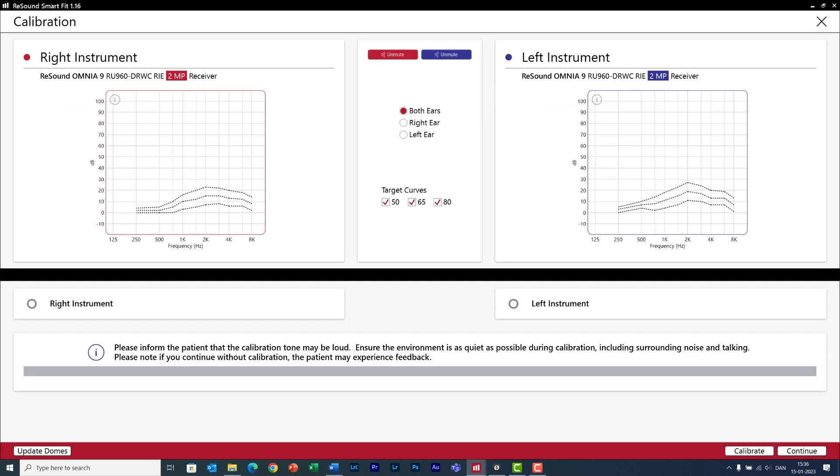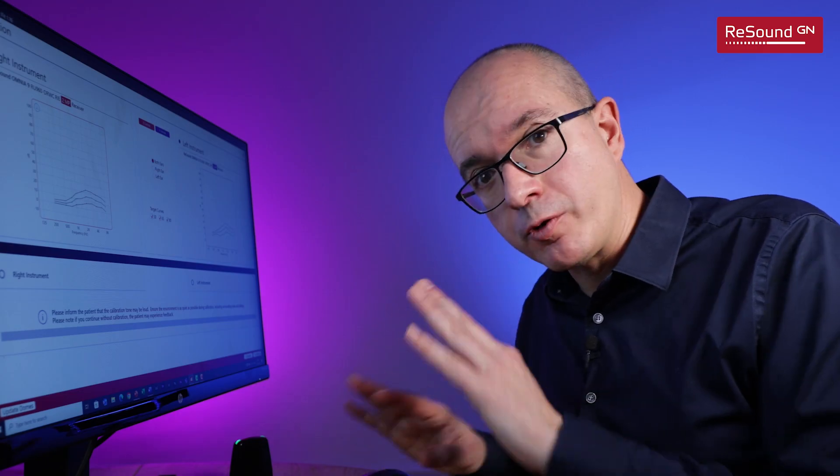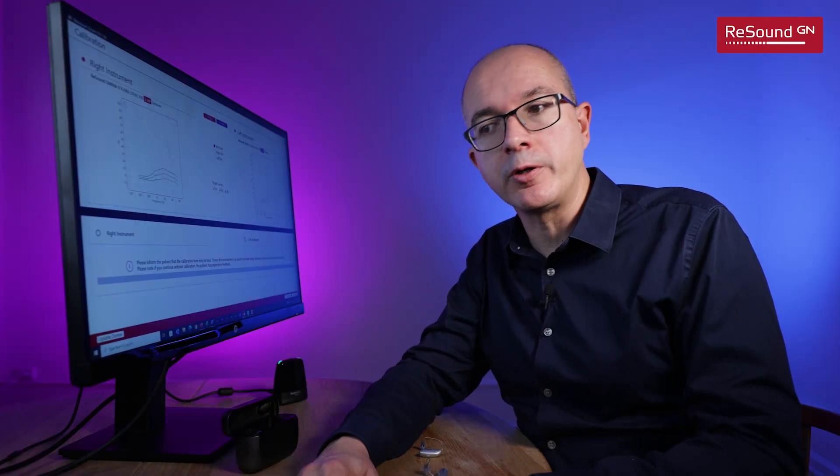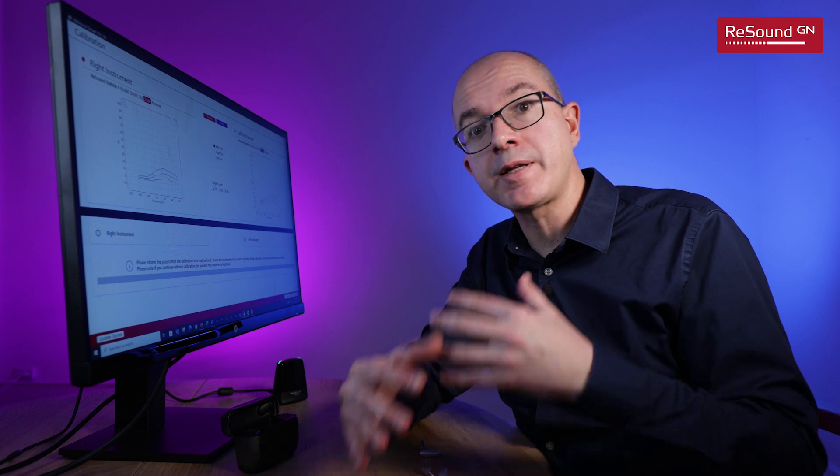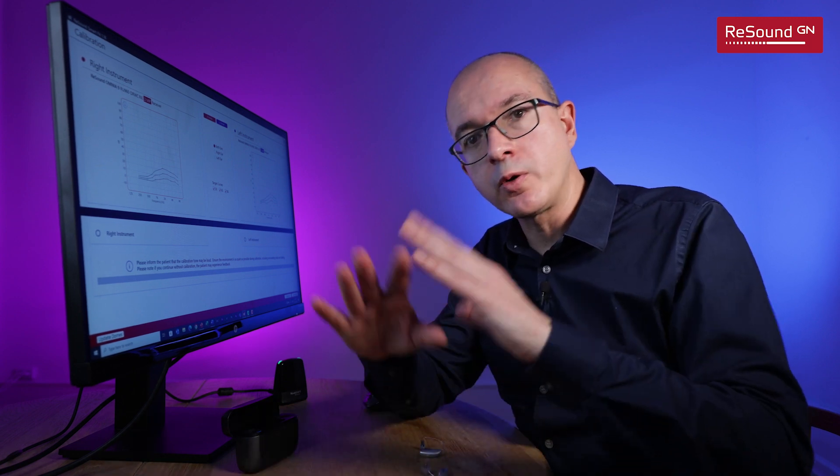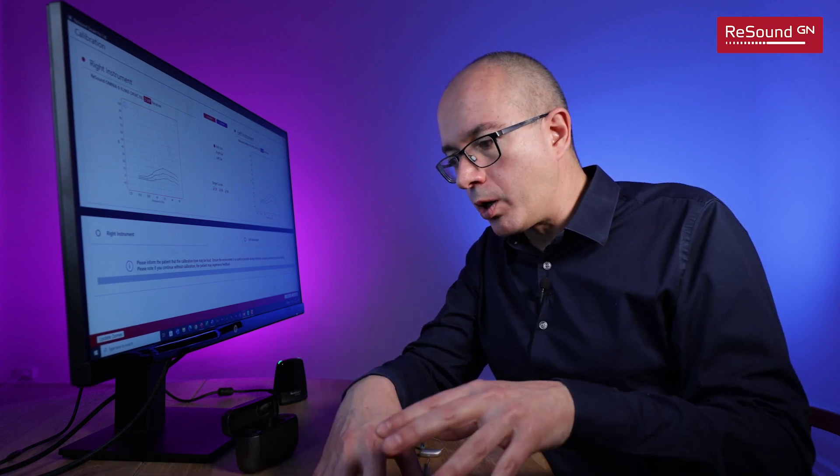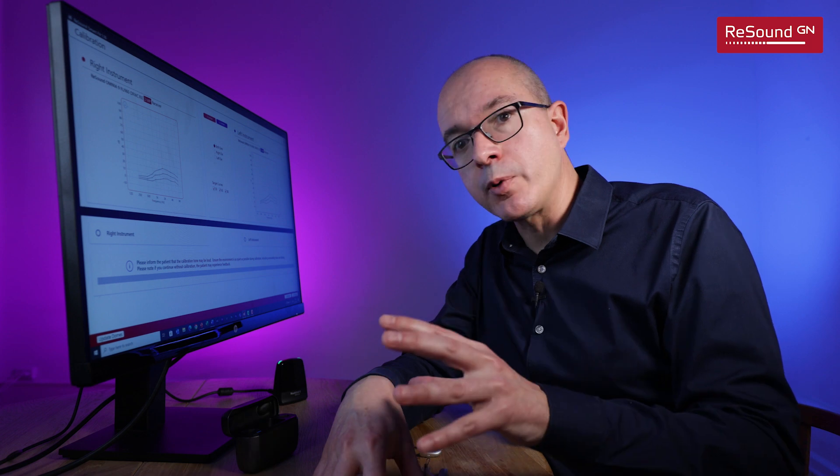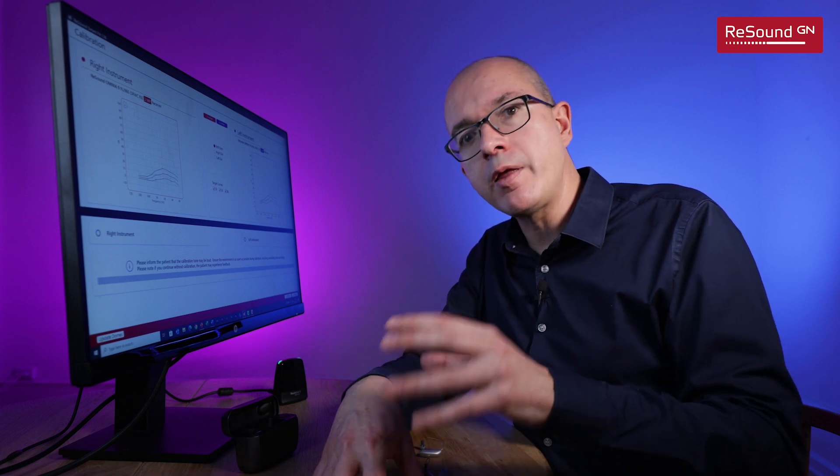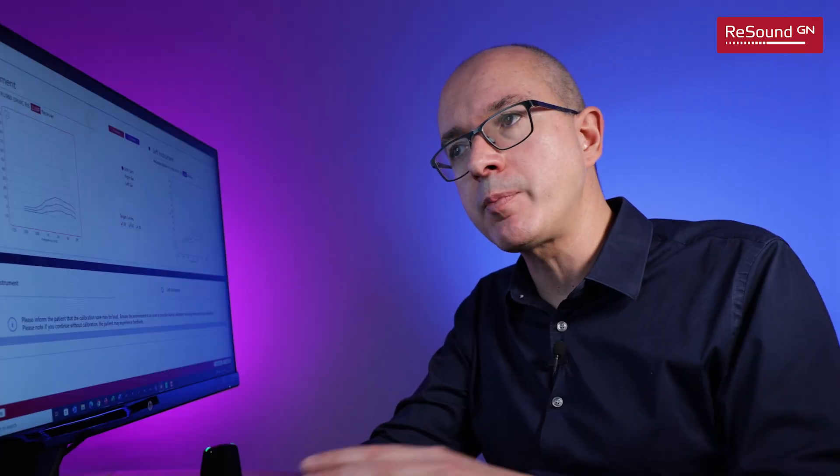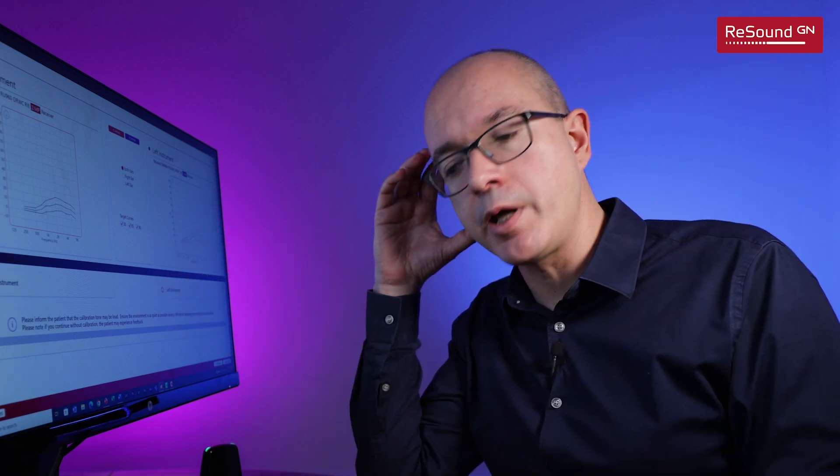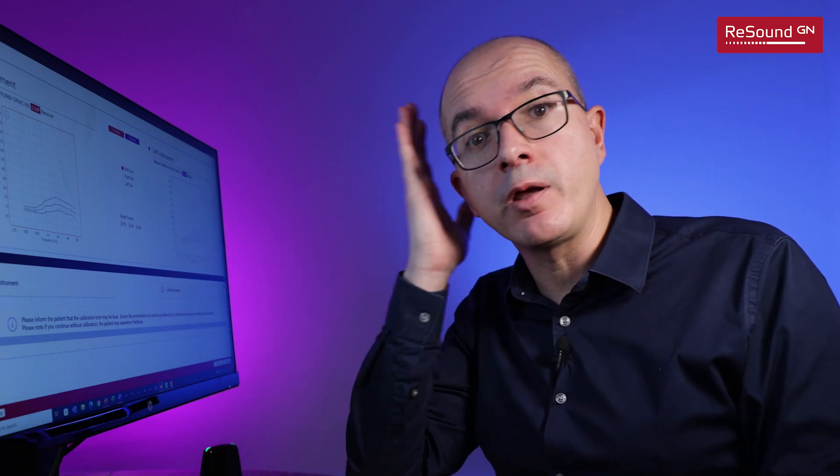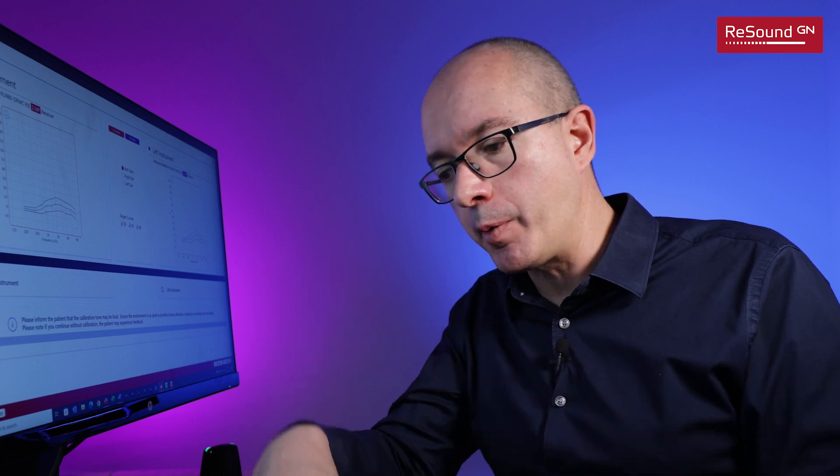The next step is the feedback calibration and this is one of the most important steps during your fitting session. You will be surprised to hear how many hearing care professionals I've met all over the world working with different brands who are not calibrating for feedback, and for me this is a big mistake because that means that you have a lot of people using hearing aids with a ticking bomb in the ear that can explode at any time.